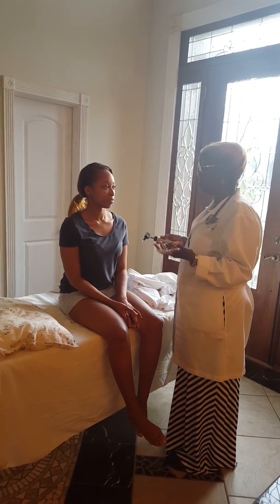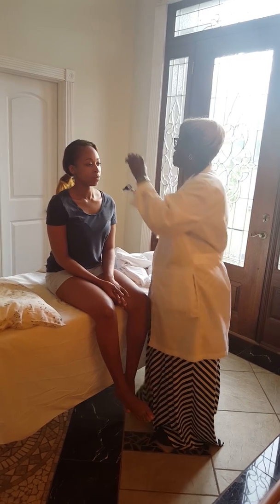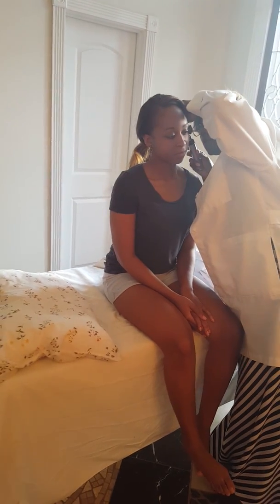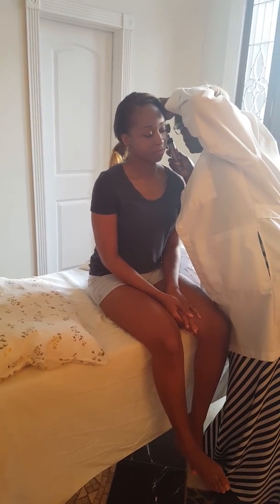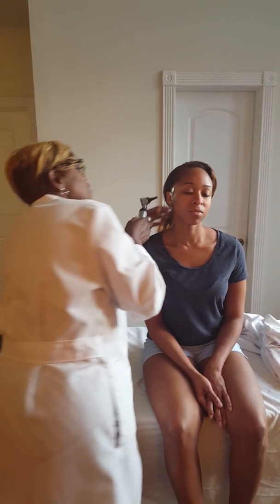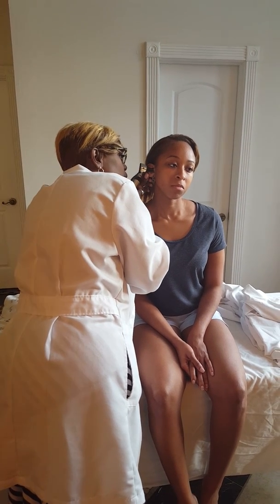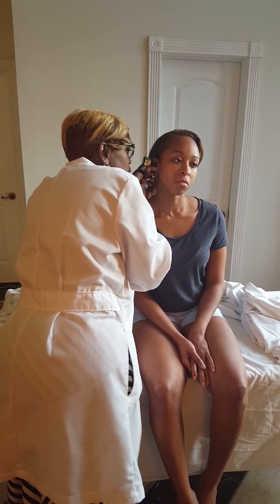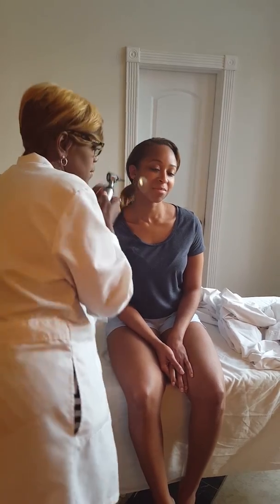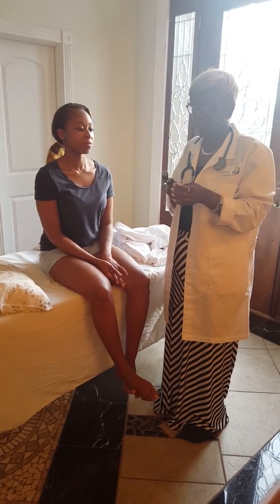Ms. Smith, I forgot to look in your ears. I know we're at the end of the exam, so thank you for being patient. Right now, I'm just gonna look in your ear canal. I'm gonna pull it up. Okay. Ear looks good without any build up. Okay, the ear canal looks good. There's no build-up of wax or anything in it.